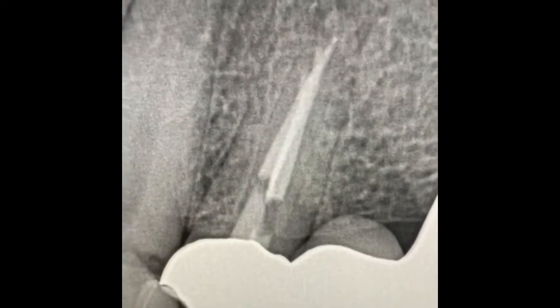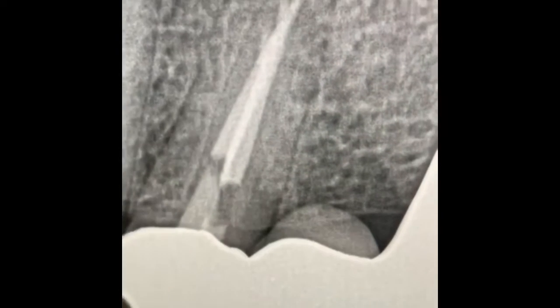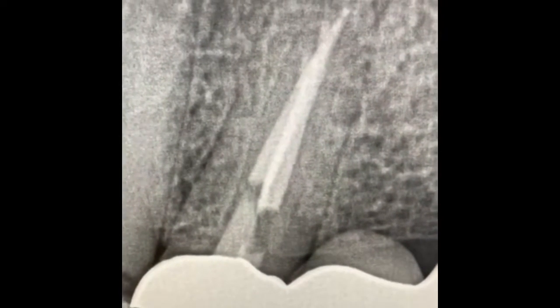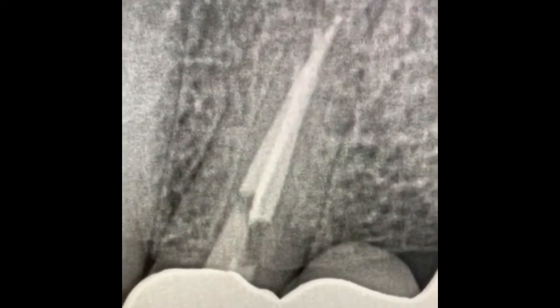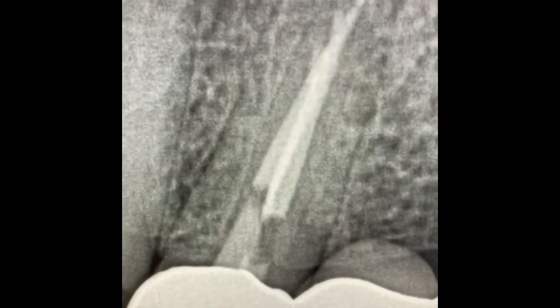This is the retreat of tooth number 12. I've removed all the gutta-percha, done copious irrigation with hypochlorite, and now my master apical file is more than 50. That means I'm going to need to use MTA — we're going to obturate with MTA instead of gutta-percha.